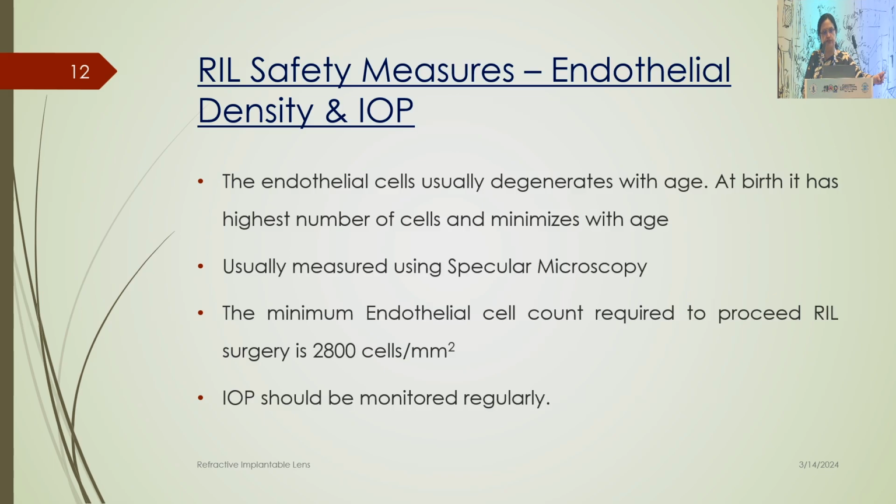Looking at the safety factors, make sure that some of these patients may have very thick pachymetry, so you have to rule out any posterior endothelial problems. So doing a routine specular microscopy is very important.